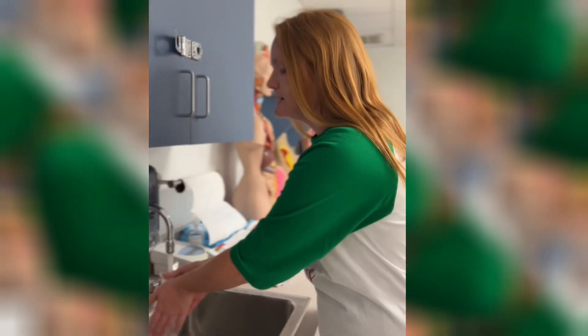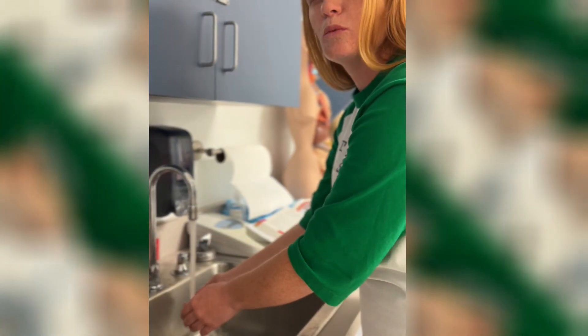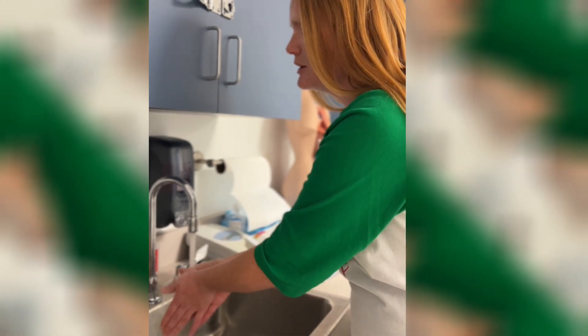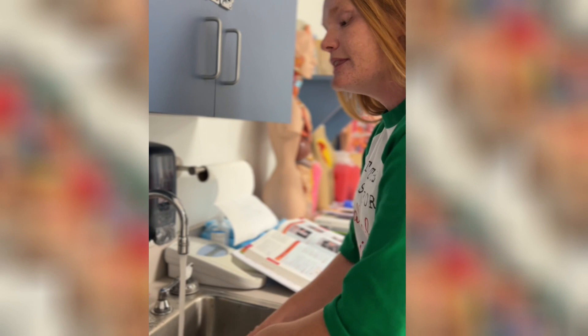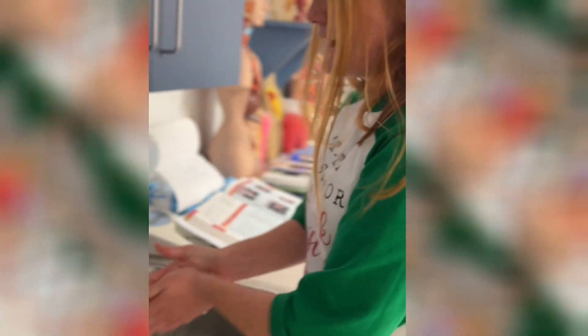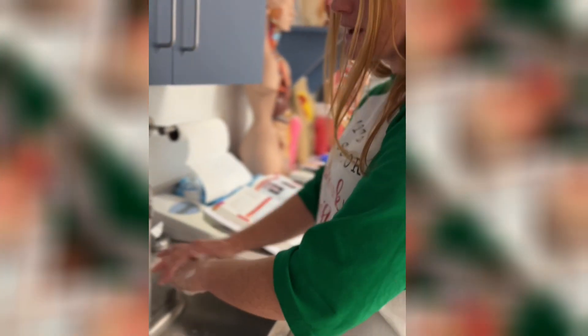Start by getting your hands wet — adjust the water to a comfortable warm temperature. Then add soap. You want to scrub each surface of your hand for five seconds — scrub the inside, then roll it over and get the back of your hands.